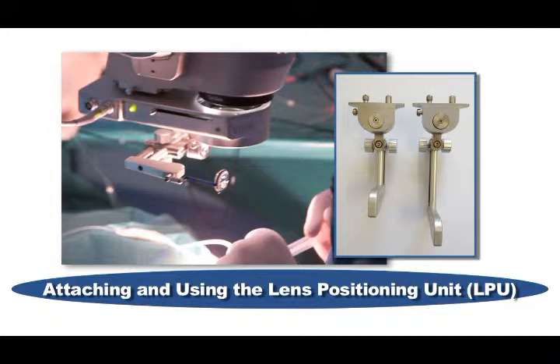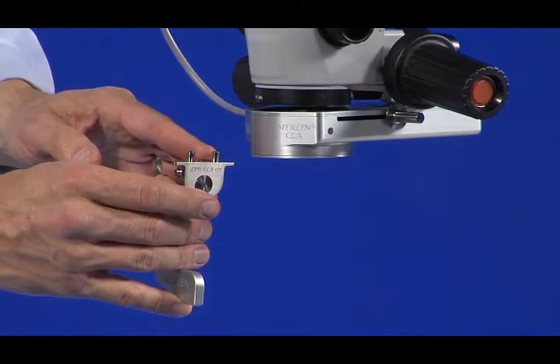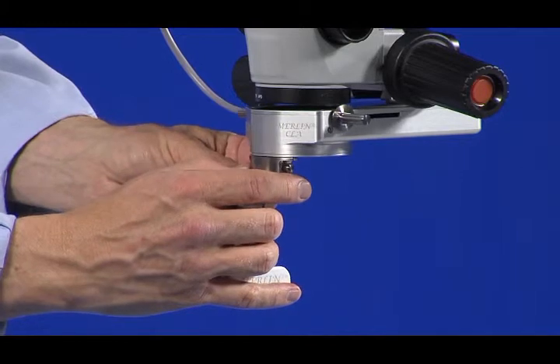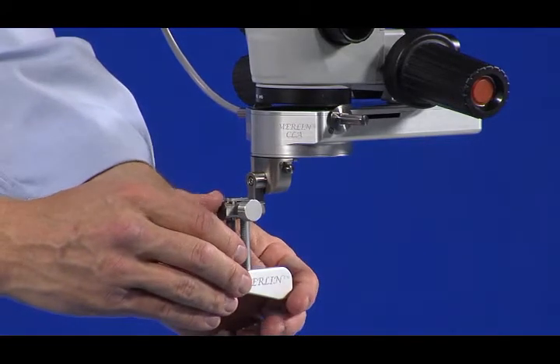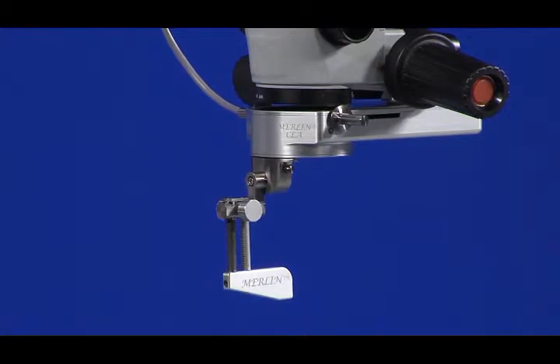Regardless of whether you have an automated or a manual Merlin CLA, you will use a Lens Positioning Unit, or LPU, as part of your system. Attach the LPU by inserting the locating and locking pins into the mating holes of the CLA. Note that the curved portion of the LPU pivot block should match the curve of the CLA housing. Confirm correct insertion of the LPU by gently pulling down on the LPU pivot block. A correctly inserted LPU will not detach by simply pulling down on the device.